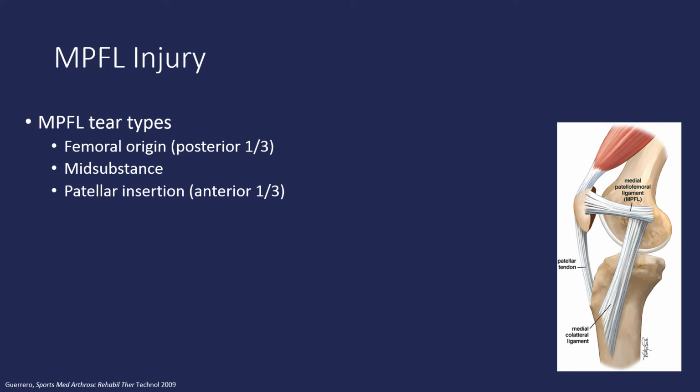Accurate characterization of the type of ligamentous tear is important because the findings from the most recent studies indicate that femoral avulsion is a predictor of chronic instability, which is why the site of the tear may directly affect surgical planning.